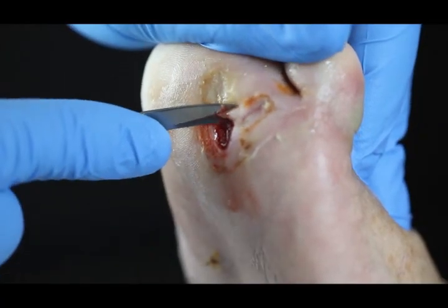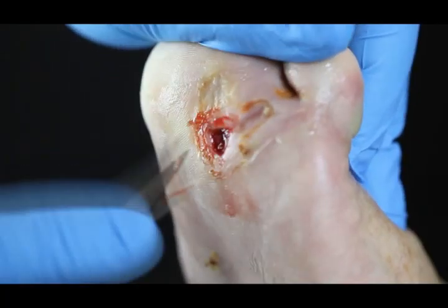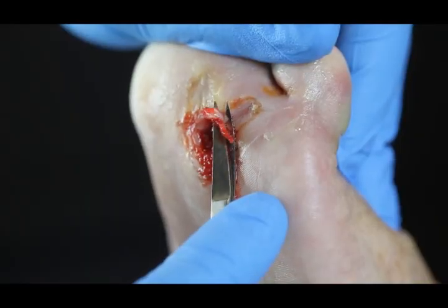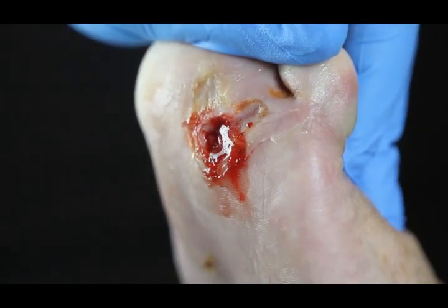We always save the skin for last, because once we cut the undermined skin, there's going to be quite a bit of bleeding, and you don't want to be working through that when you're trying to take off the biofilm.